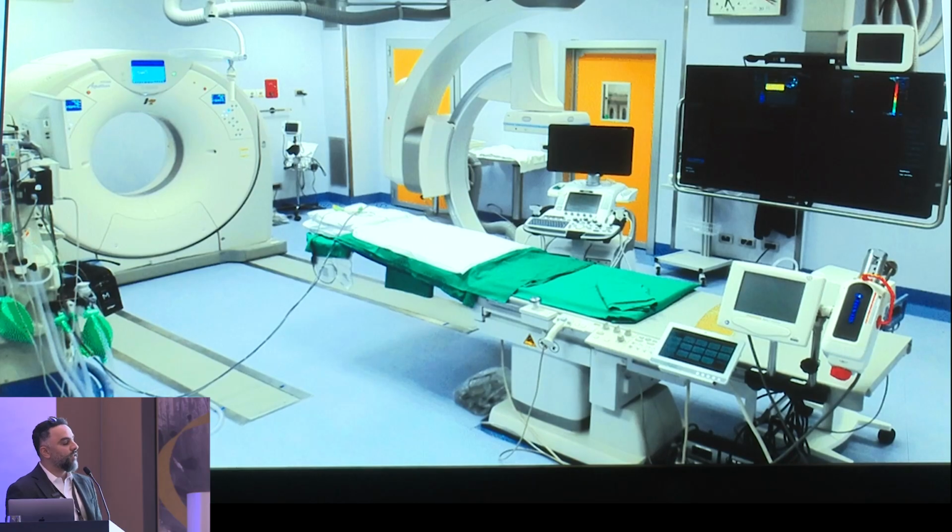Okay, so patient selection is very important to consider while you give an injection. We know there are so many different types of injection, basically anabolic, catabolic, prolotherapy, hyaluronic acid, PRPs, and Botox for some cases that we use, and one of the cases I will discuss. Now for the shoulder, intervention suites have a couple of modalities: CTs, C-arms or fluoroscopy or angio, and the ultrasound. Mainly we're dealing with soft tissue, so I'm going to talk about ultrasound injections.